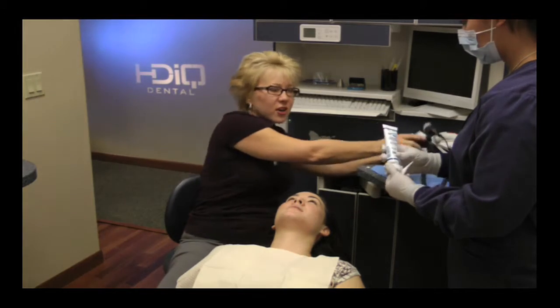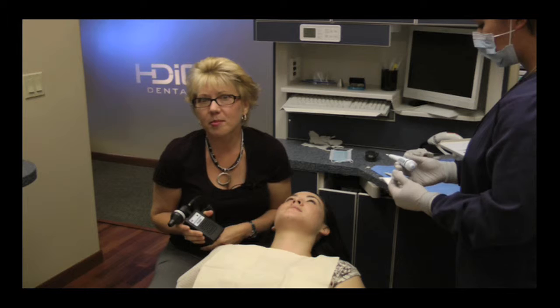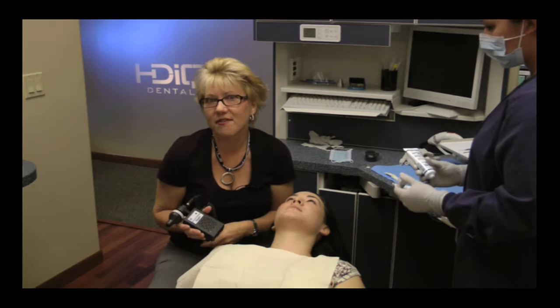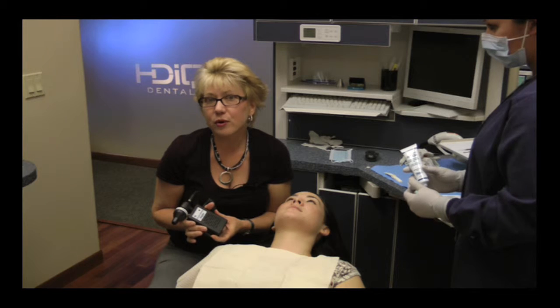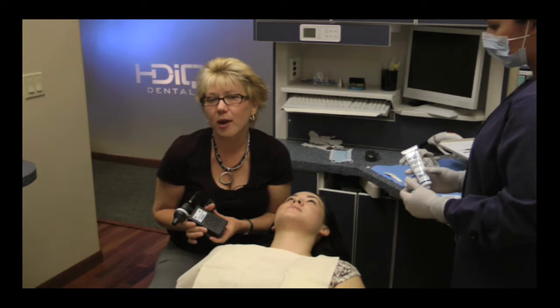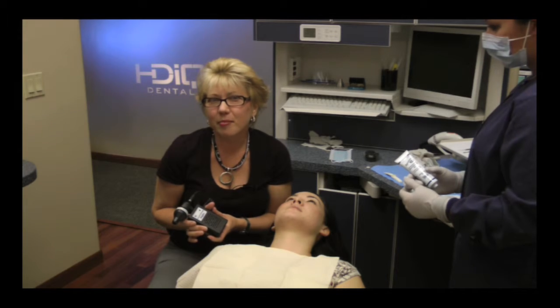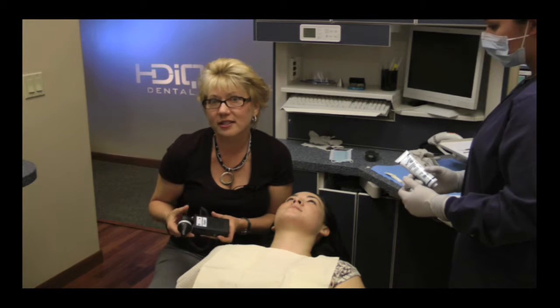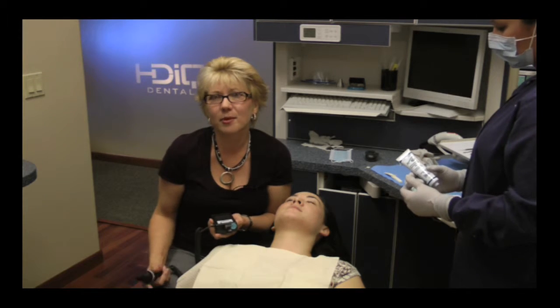So let's just start by talking about the Doppler. There are lots of places to get a Doppler. This happens to be the one I use in my office that I got from Great Lakes Orthodontics. One of the things I want to do first with a Doppler is make sure and test the batteries. Dopplers can very easily create a lot of false positive background noise as the batteries are starting to die. So the first thing that I do is simply turn the Doppler on and listen.